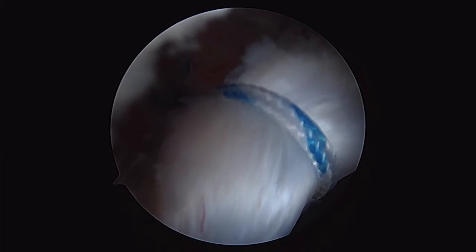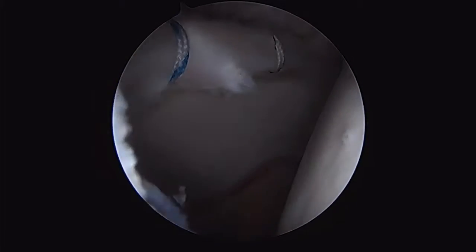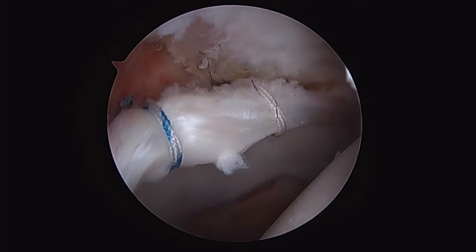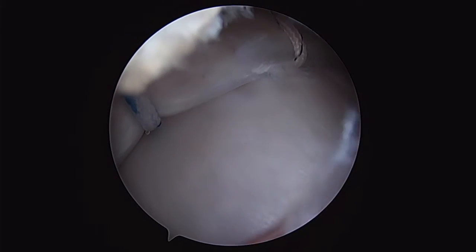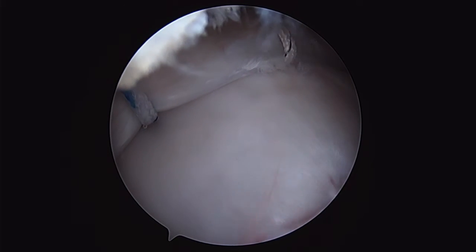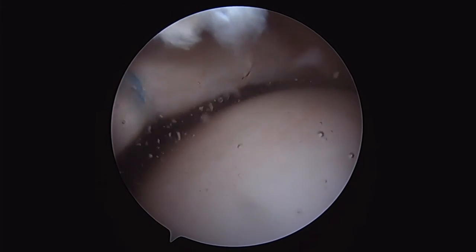Now that I've got the sutures down, we'll take the hip out of traction and assess the suction seal. If we don't see a good suction seal, we would consider placing additional anchors. We're pulling back out of traction, and we see a nice suction seal of the labrum.